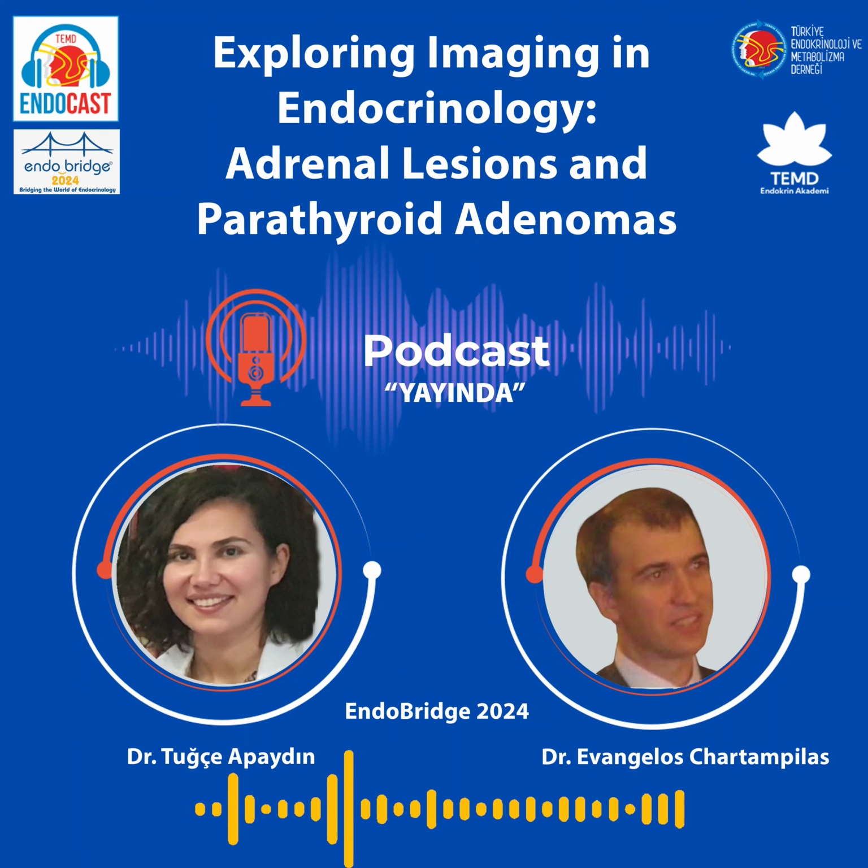Also, I would like to ask, how should we decide in cases of discordance between sonography, scintigraphy, and 4D CT? That is a very difficult question. I think sonography has a little role to play, because if the lesion has the typical appearance of an ovoid, hypoechoic, encapsulated lesion with a polar artery, this is fine, it's an adenoma.